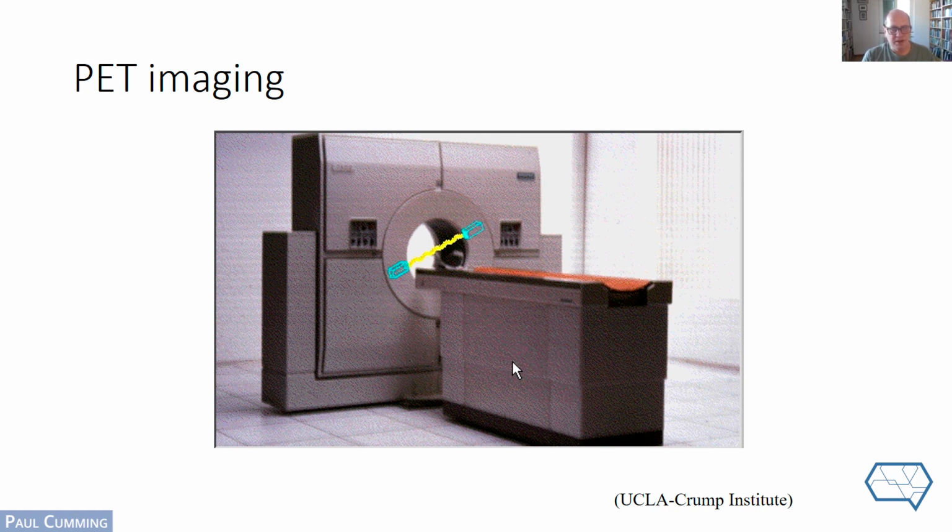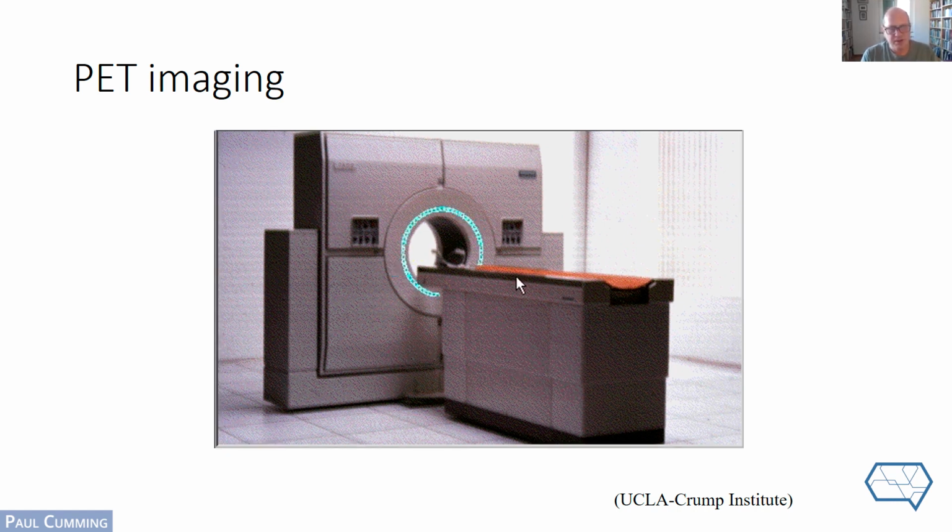And then you see hidden behind the white chassis of the scanner, there are rings of detectors, and here two of them are linked together and they happen to register that particular decay event. Next slide. There is a ring detector. Actually, modern scanners have many rings extending over very large fields of view, all wired together in a nightmarishly complex and expensive piece of apparatus.